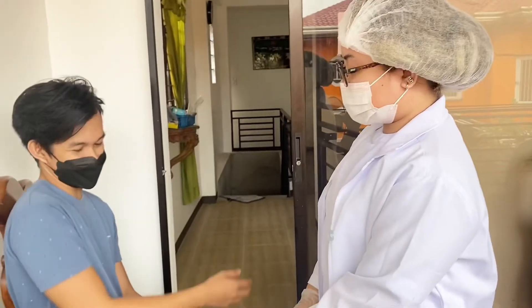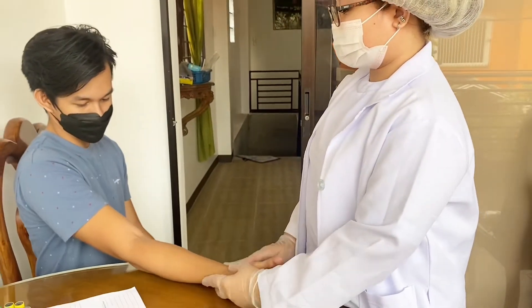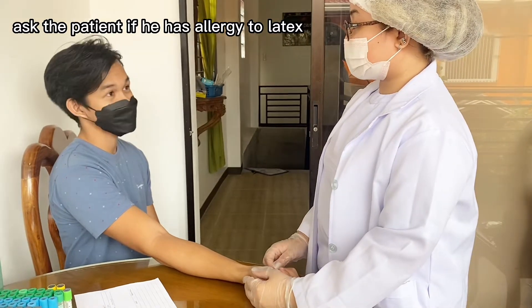Sir, palalina naman muna kamay. Meron po kayong allergy sa latex?